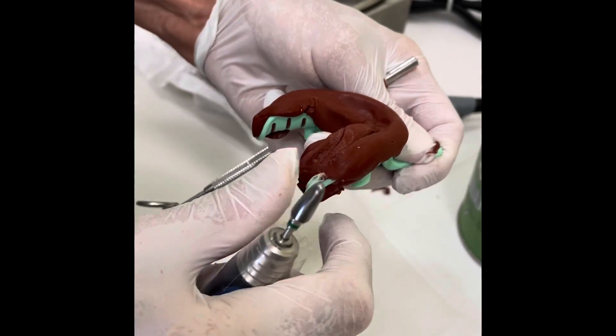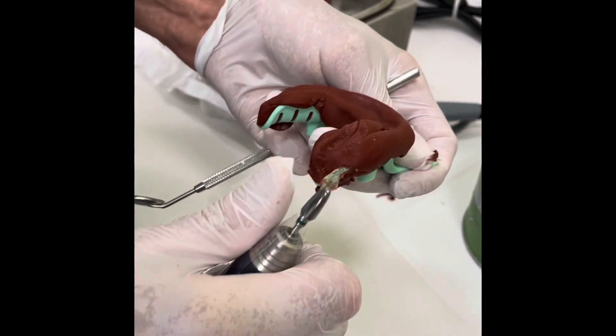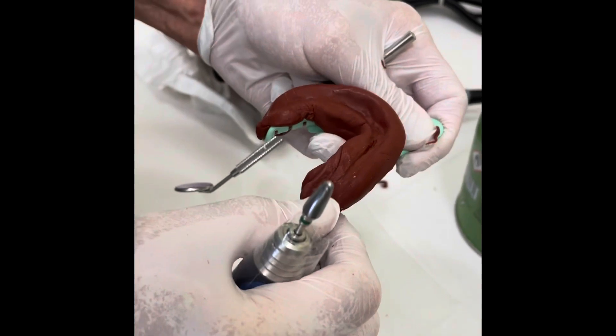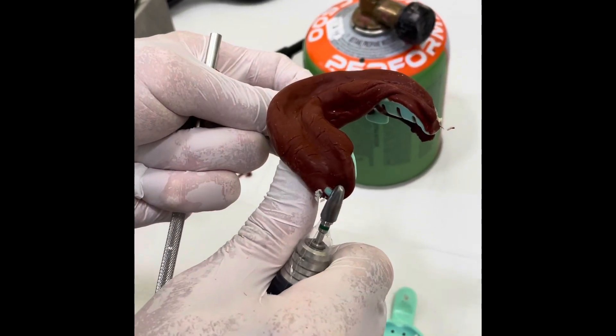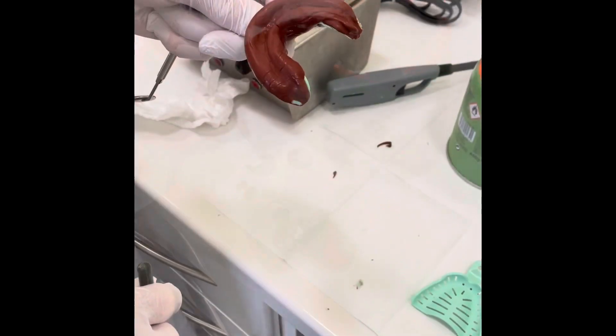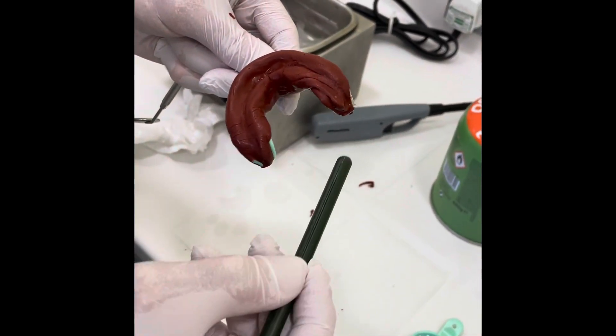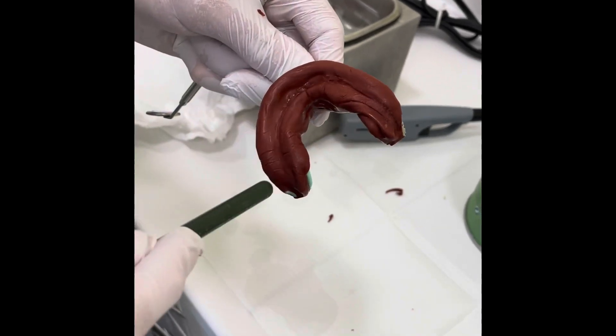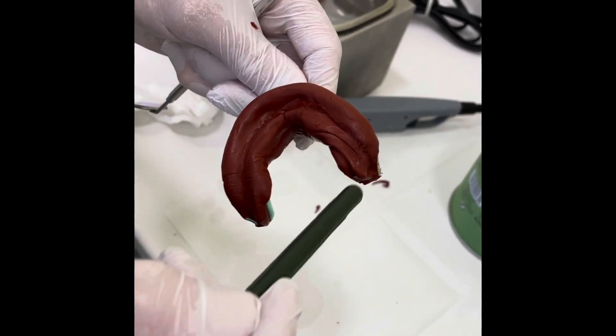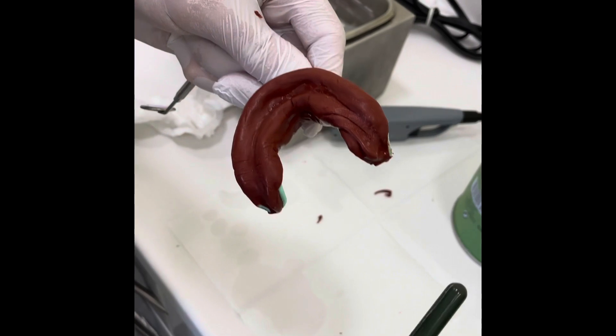If you use a coarse burr it won't block the compound — just trim that bit off. So now we're looking to get a bit more lingual extension. Try this back in — there's no more discomfort. You can see the ridge; we've got over-extension here, but there might be a bit more lingual extension to be achieved, so we green stick one side at a time.